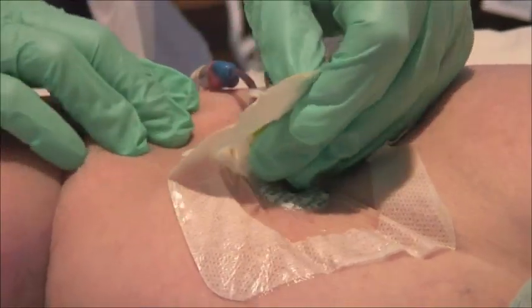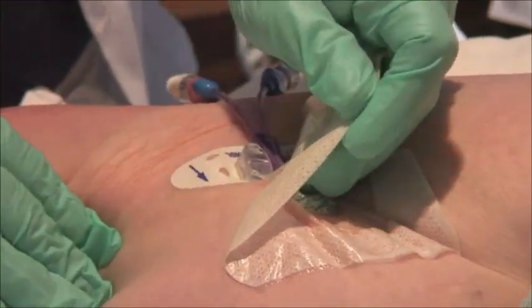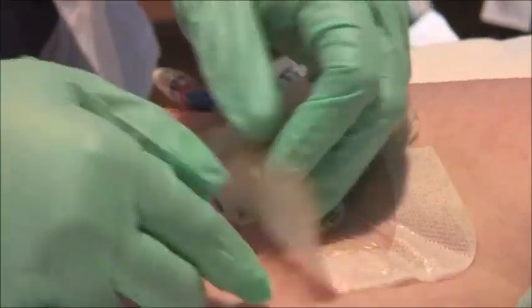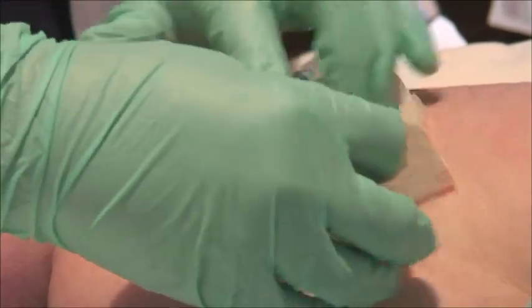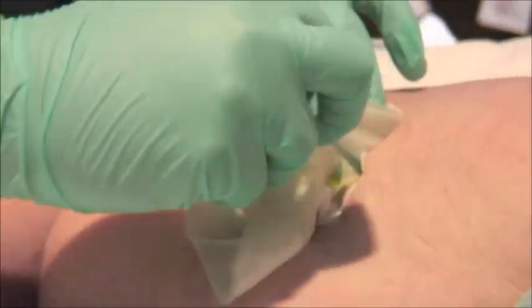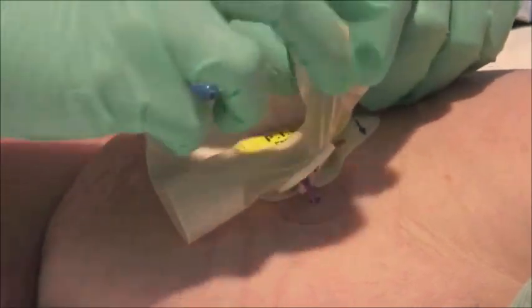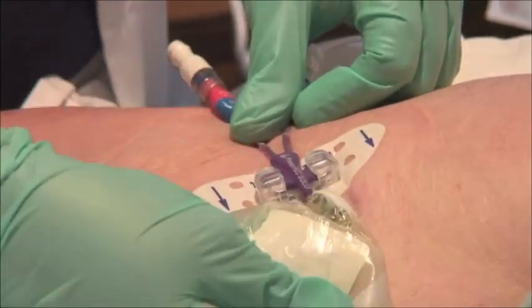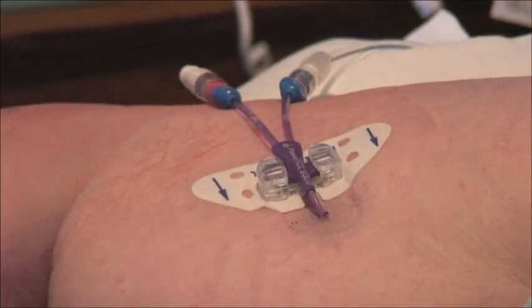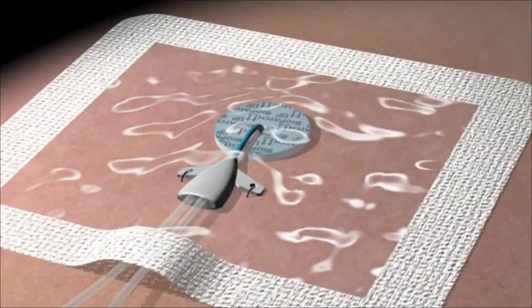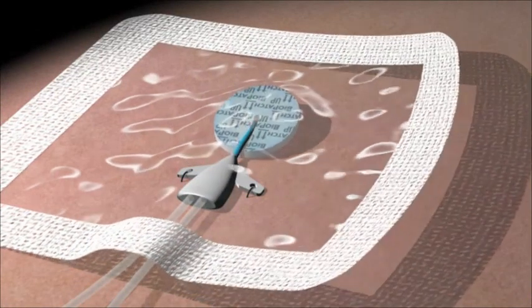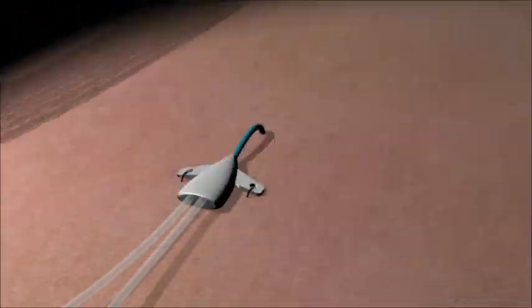When changing BioPatch, first remove the transparent dressing by picking up the corner of the dressing and stretching the dressing away from the catheter. Holding the catheter in place, the dressing will partially peel back until resistance is felt. Repeatedly stretch and peel as necessary until the dressing is removed. BioPatch will remain attached to the transparent film dressing, so removal will be simultaneous.